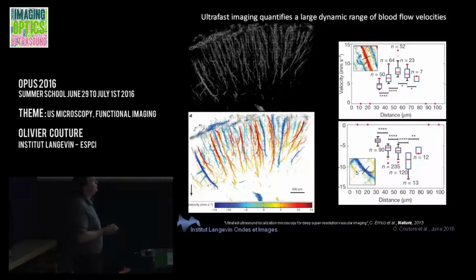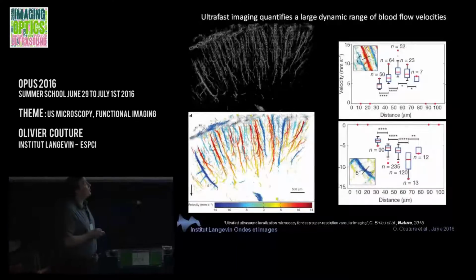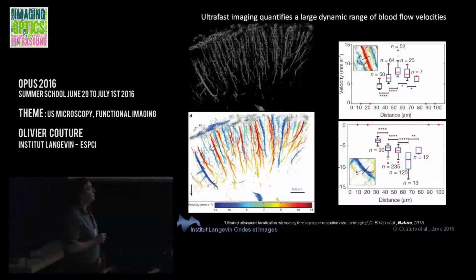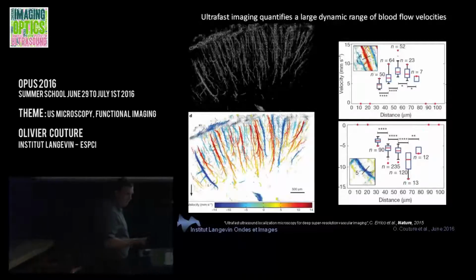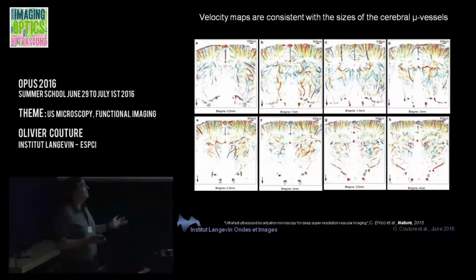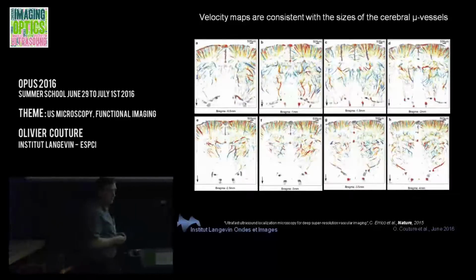what we did is that we reconstructed the image with a different resolution, a smaller and smaller resolution, and then we were able to keep statistical significance between each of the points until we reached 8 microns in pixel radius. So to us, the resolution of this methodology is about 8 microns. So obviously you can do these maps since you have the bubble positions. So this is the nice thing also, is that you're not talking about images, you're talking about bubble position now. So you can do all these things with vectors, and you can do all these planes.